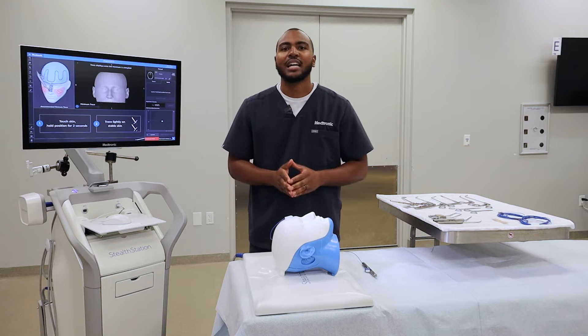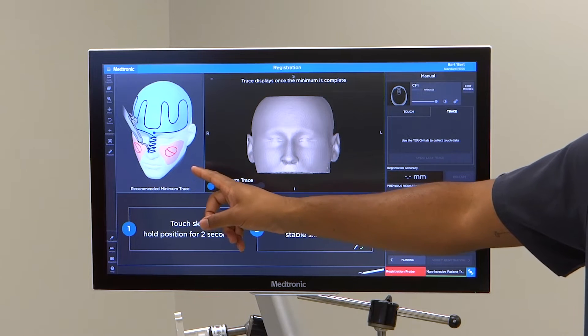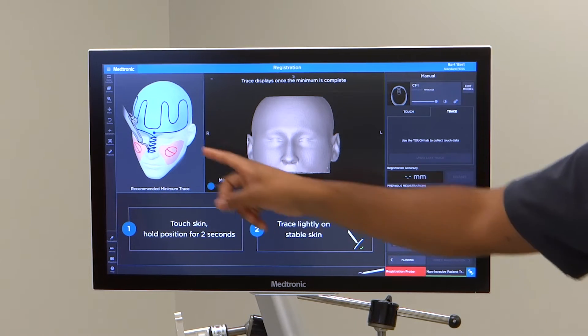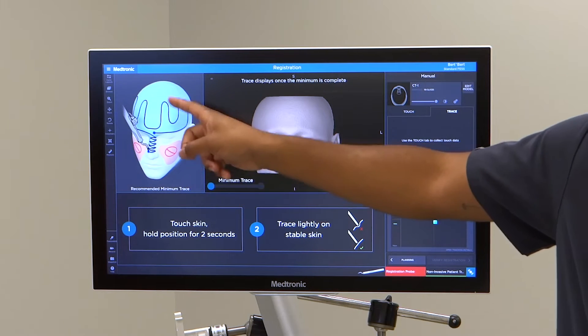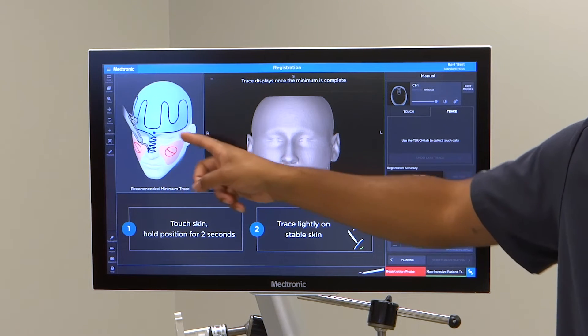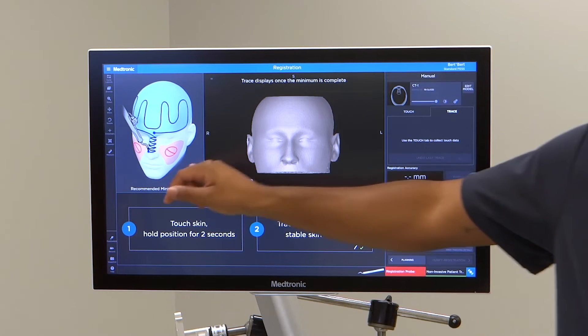Before beginning registration, I recommend viewing the image on the left-hand side of the screen, which shows a recommended tracing pattern to follow. It takes you all the way back by the ears, up the forehead, and all the way down the bridge of the nose to the tip of the nose. It also points out areas on the cheek to avoid.